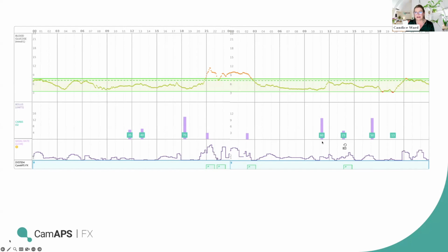And you can see she's getting away with 60 grams of carbs after breakfast, but that probably is not as good as the 35 and 40 she split the day before around the lunchtime mark. In the evening here, you can see a different excursion. The algorithm has actually not been able to save the hypo.